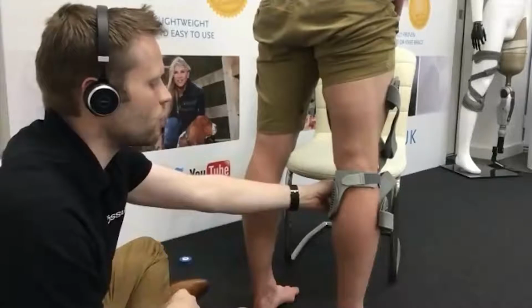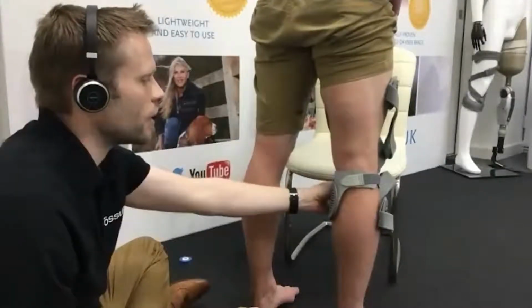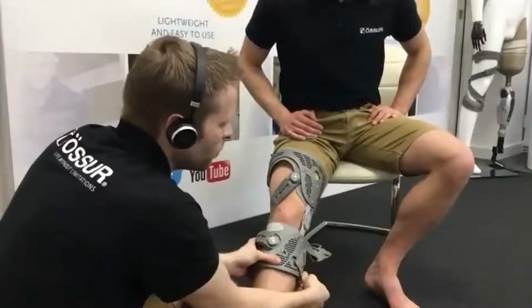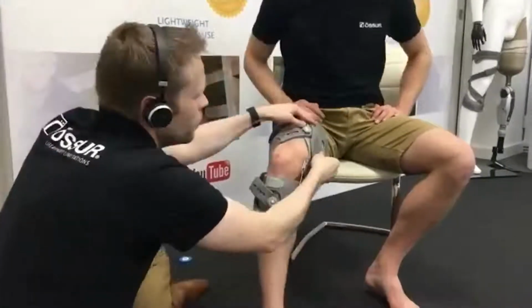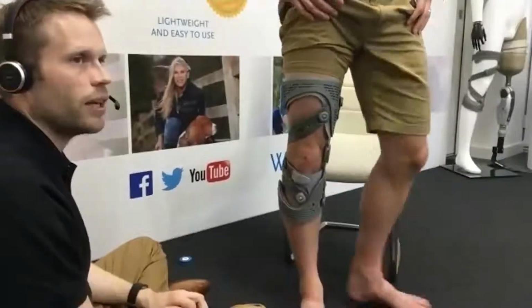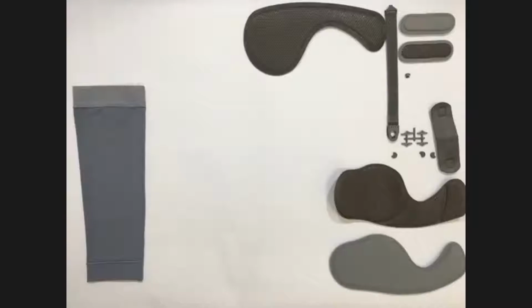Can be really useful for patients of high activity level or if they're getting quite a lot of sweating. Once we've anchored that, we just continue to fit it in our normal way, fastening blue on top of that little shelf, fastening it into position, bend the knee, clip that in, and we're then good to go. So you can see it fits in exactly the same way and fits underneath the brace. From there we're going to go back to the table and talk about the gastroc strap.